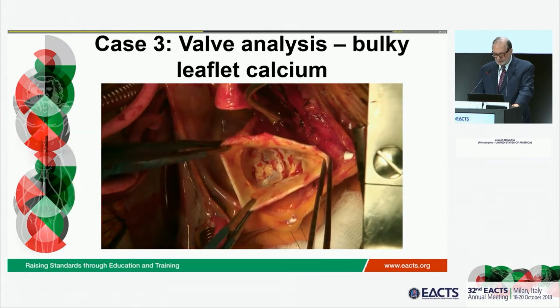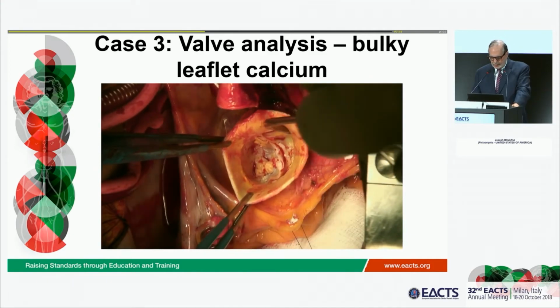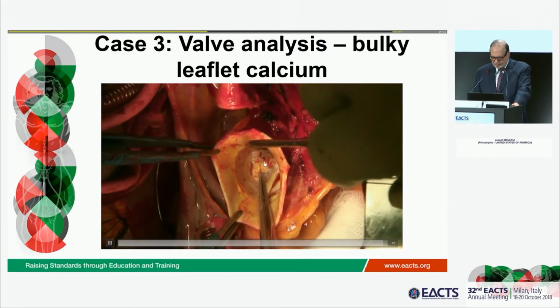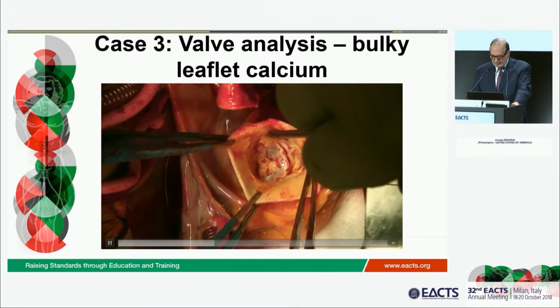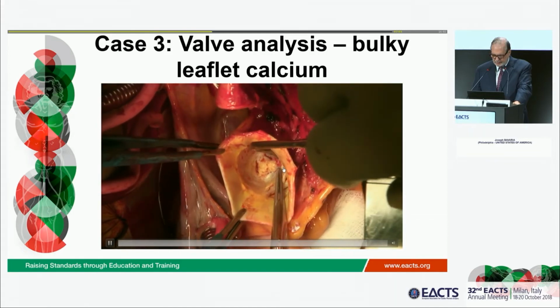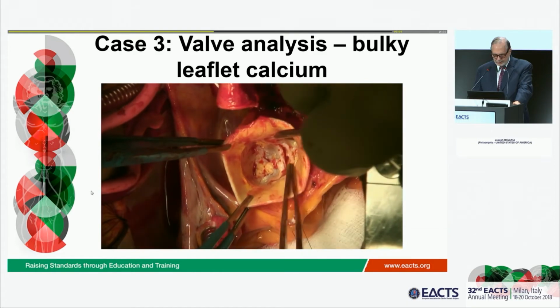So here's what we're looking at. What not to do. Here's this conjoined leaflet over here. Here's the non-conjoined. You see this calcium. He's only 49, and this is a big calcified load right here. We'll take a look at this leaflet. You can see the valve here, I'll show it to you a little bit later. We'll go to the next one.